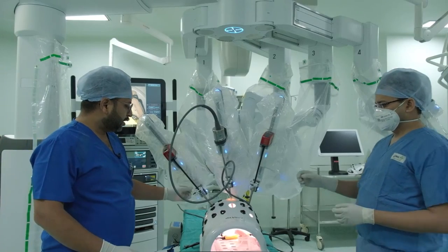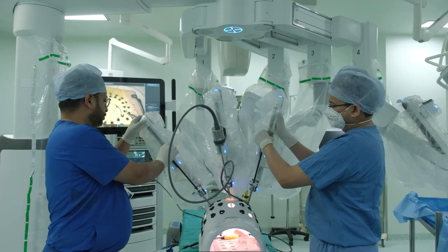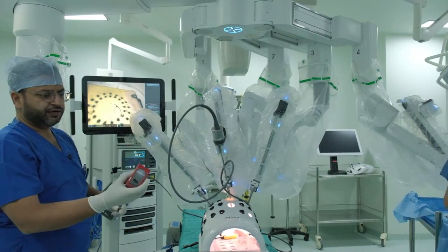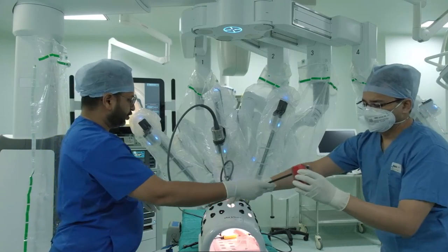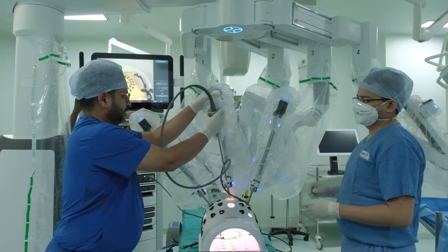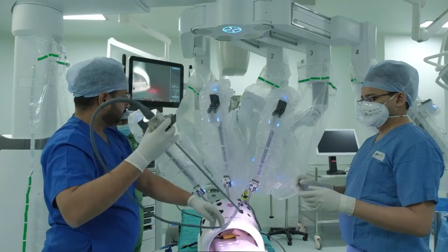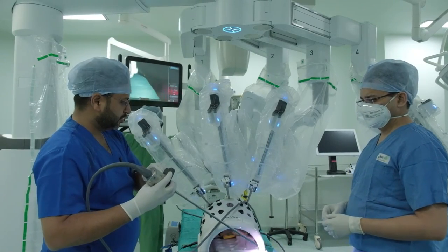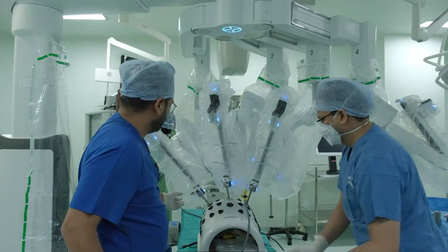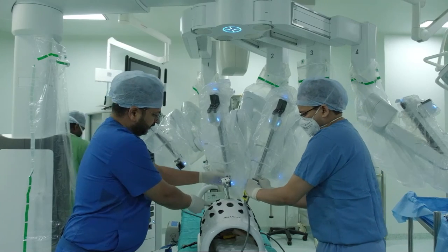So now we undock the instruments. Dr. Tushar is going to remove this instrument and I am going to remove the bipolar. There are release levers which we press on the housing to remove the instruments, and then we remove the camera as well, and then we undock. We switch off the illuminator, we can now undock. So we press this clip here and we undock now. It's a pretty quick procedure.